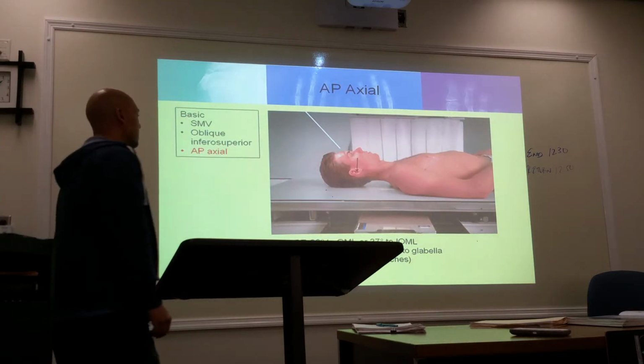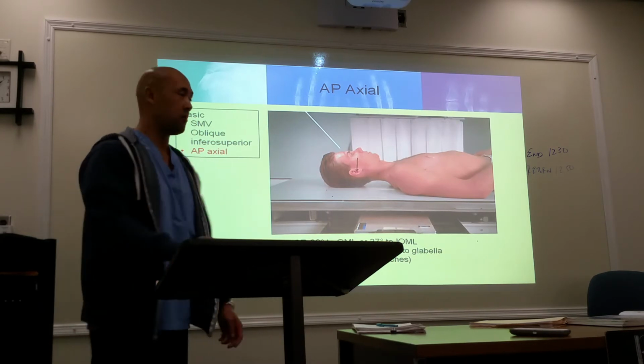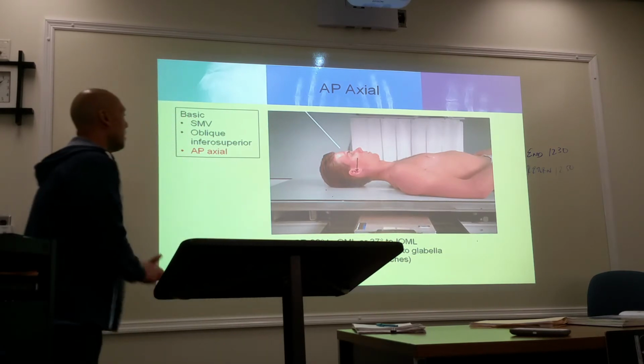All right, AP axial. We're still on the zygomatic bone, the arch. All right, the AP axial.